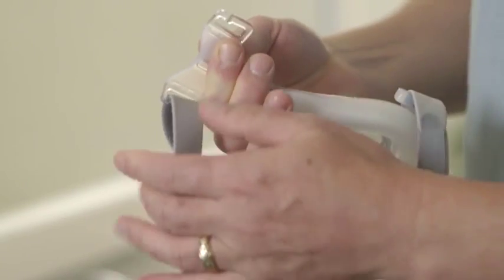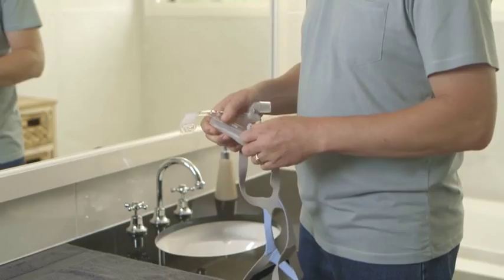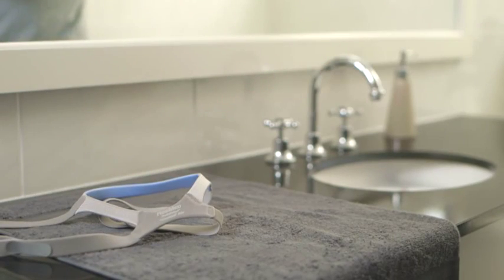To disassemble, just slide the headgear off the top hooks and then the lower hooks. You don't need to open the tabs every time you clean, and by keeping them in place, you'll retain your headgear fitting settings.